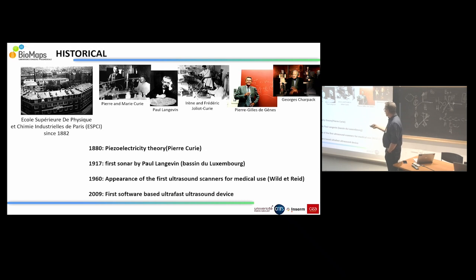And after that, in 1960, the first ultrasound scanners arrived on the medical market. So it was not so long ago, 70 years ago. And once again, in the school, in 2009, we developed the first software-based ultrafast ultrasound device, and the last part of my presentation will be focused on this device.